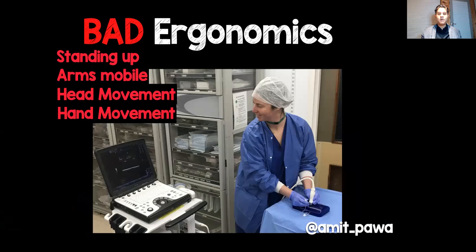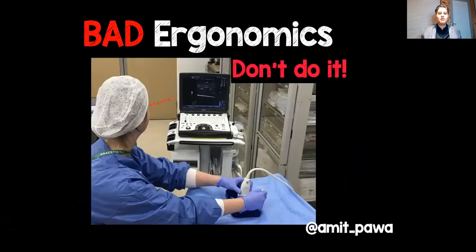She's standing up, her arms are mobile, her head has to move to look at the screen and then to look at where she is. And again, her hands are going to move relative to each other. So that is bad. So she thought, you know what, I'll have a seat. So she sat down, but look at this, she's still having to look across at the machine and then down to where she is, and she's got no idea where the needle is. She's needling toward herself. So this is bad ergonomics.